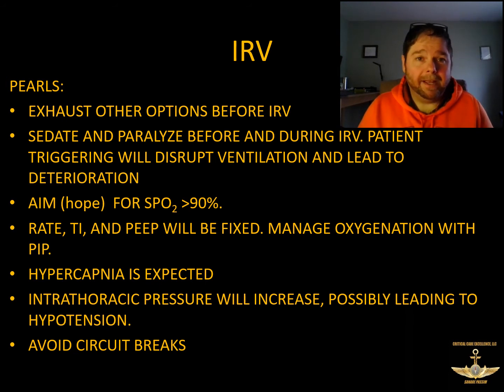When you get to that bedside, see what that patient is oxygenating on the hospital ventilator settings, especially if they're already on APRV or on bi-level or even inverse ratio. And if the best they're doing on their hospital ventilator is 88%, then that's probably the best you're going to do. So don't drastically increase the peak pressure trying to get to a normal oxygen saturation, because you're probably not going to do that. I mean, that's why we started this mode in the first place, is because somebody was really sick and had really poor oxygenation, and so managing our expectations of what that's going to be means something less than that.